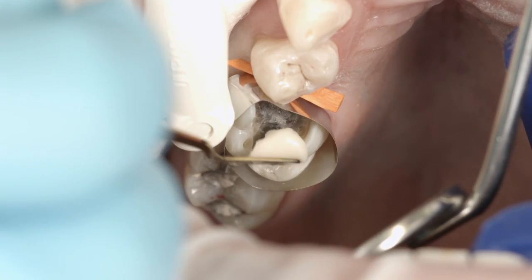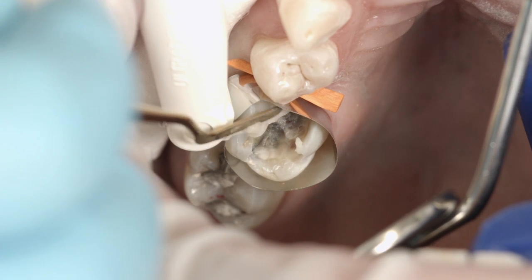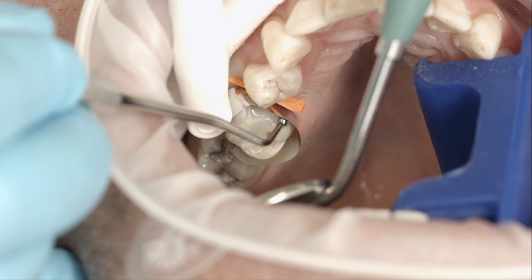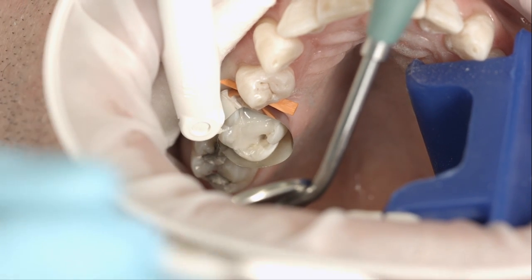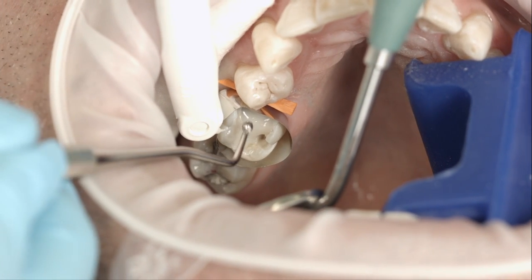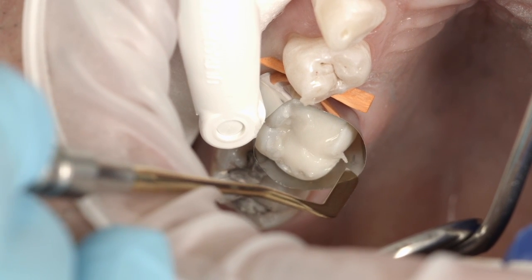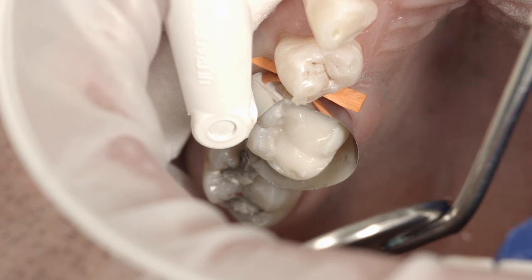You may apply as much Sentient N as you see fit. Carefully pack the material into the cavity. Given its self-curing properties, the material can be applied in any layer thickness. Remove occlusal excess material. The working time is 2 minutes and 30 seconds.